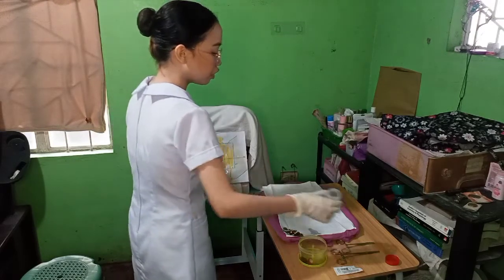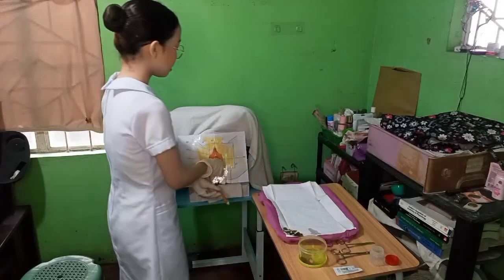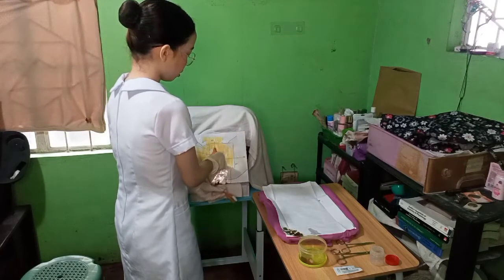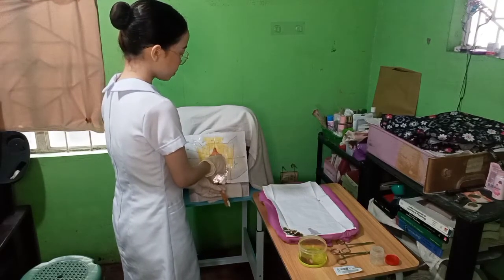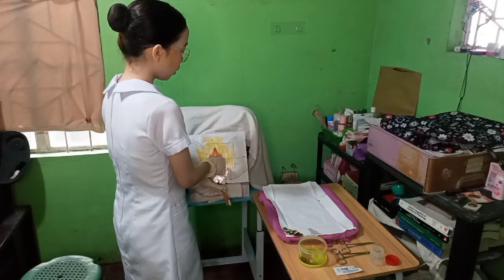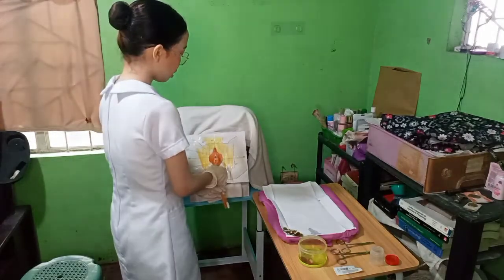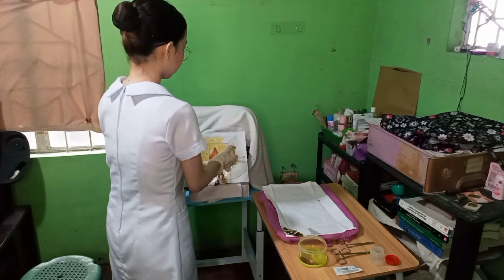And then after obtaining enough amount of urine for urinalysis to be sent to the laboratory, fully empty the bladder and wait until the urine stops. And when the urine stops, remove the catheter by pinching and removing it smoothly.